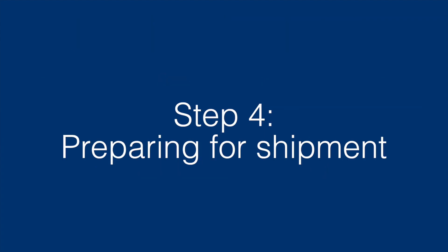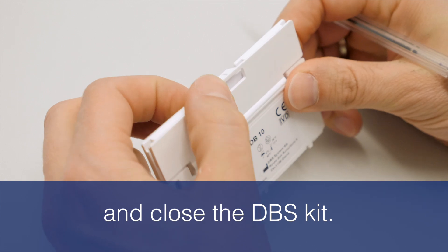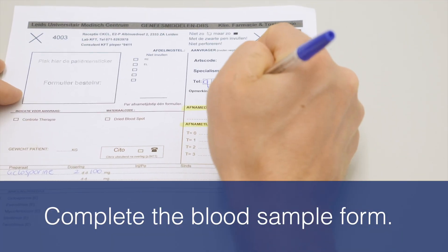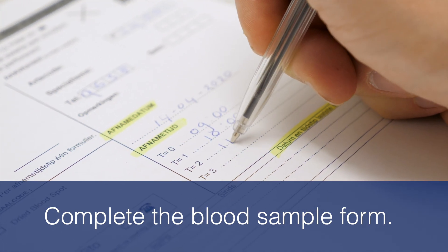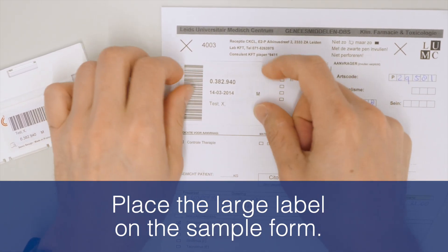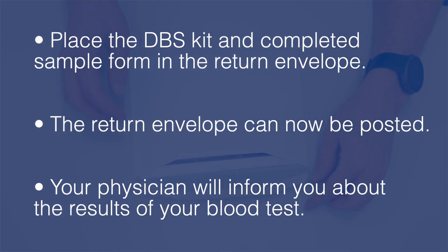Step 4: Preparing for shipment. Mark each blood spot with corresponding sampling numbers and close the DBS kit. Place the small label with your information on the DBS kit. Complete the blood sample form and fill in the time points when you sampled your blood. Place the large label on the sample form. Put the DBS kit and completed sample form in the return envelope. The return envelope can now be posted.